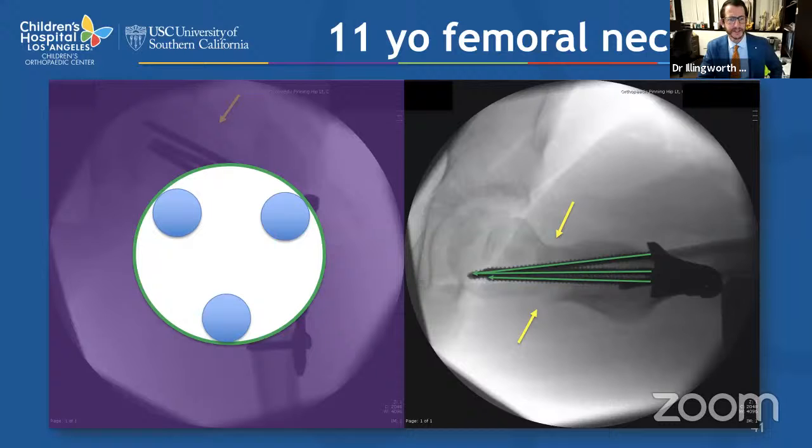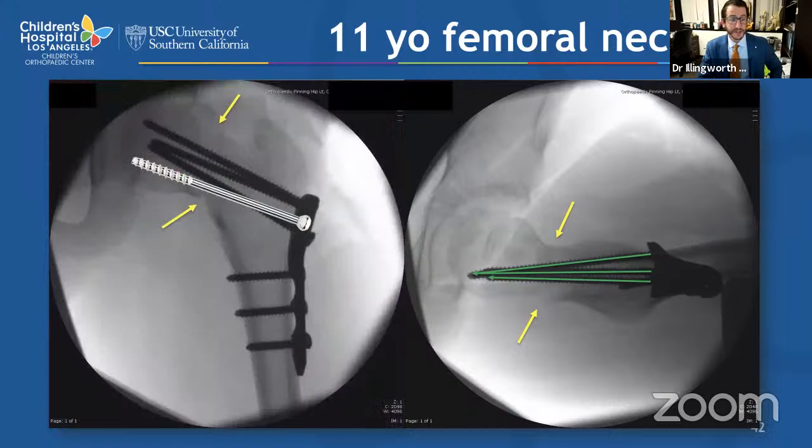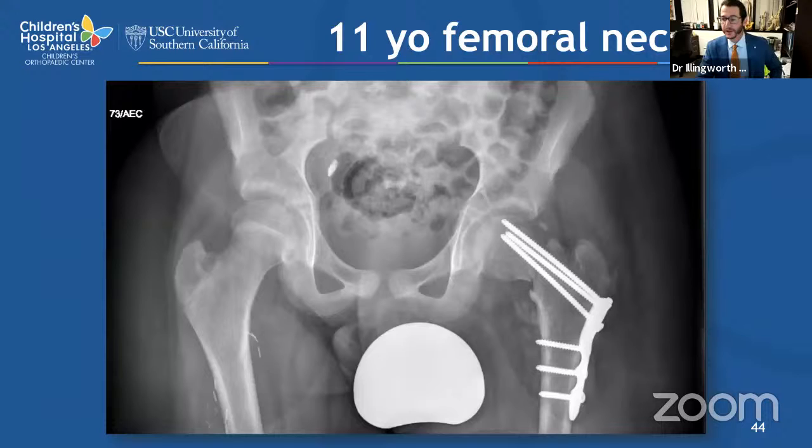I personally use an inverted triangle when I'm doing either cannulated screws or a proximal femoral locking plate. Like I said, I prefer to have good fixation along the medial calcar as low as you can go in order to buttress that particular area, but in a non-anatomic reduction, that may be a moot point. So this was his post-operative radiographs 2 weeks after his operation.